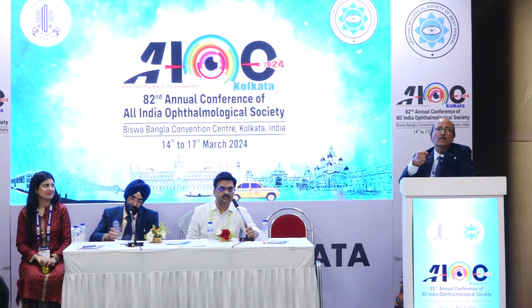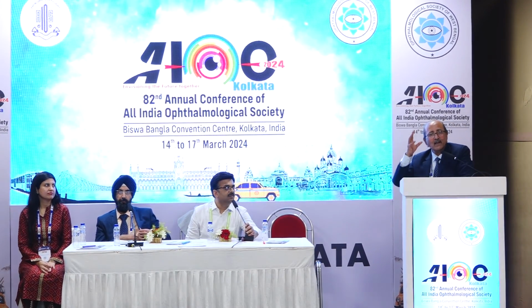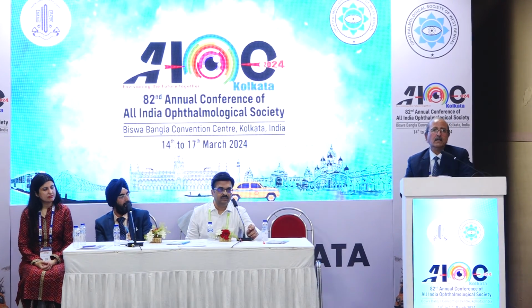But that keratometry will also change. Initially it may be say 48 to 50, and it will come down to 43, 44. So that estimate also you have to balance. It is a bit complicated, and whatever we do is not 100% accurate, but it should be reasonably accurate.